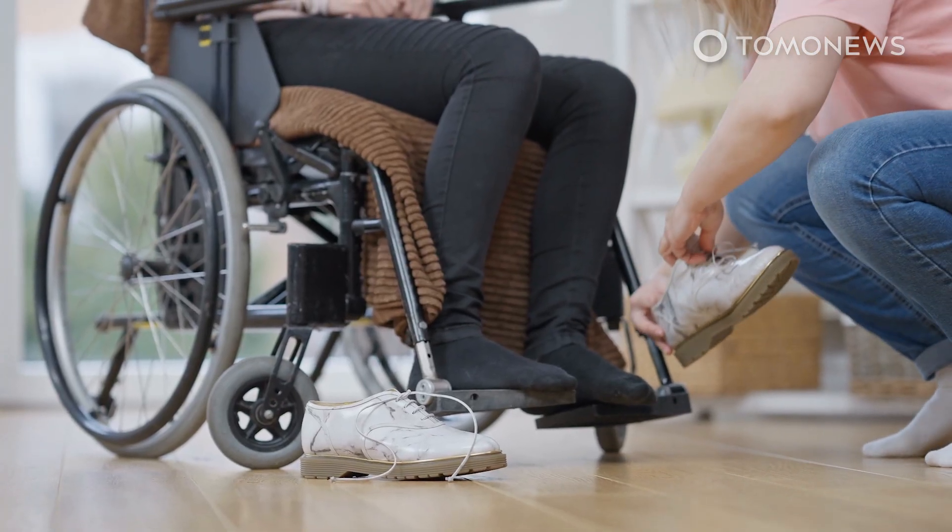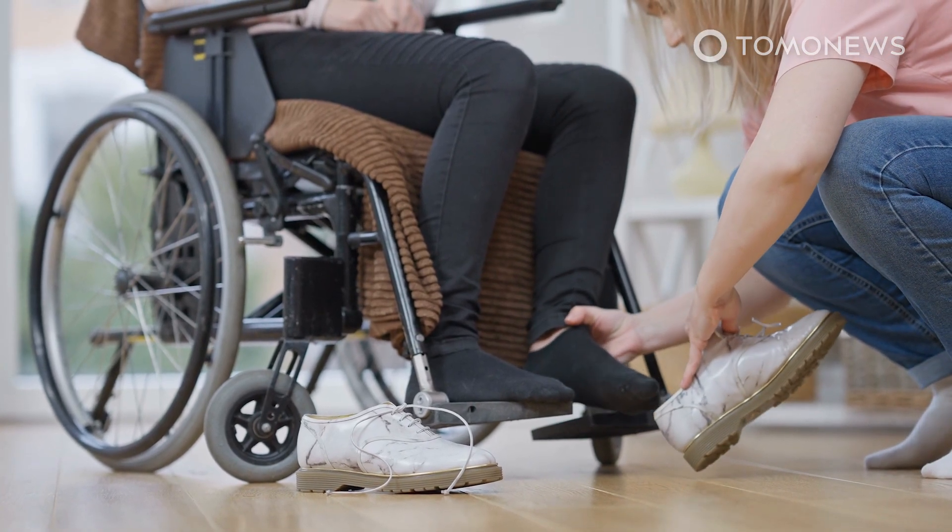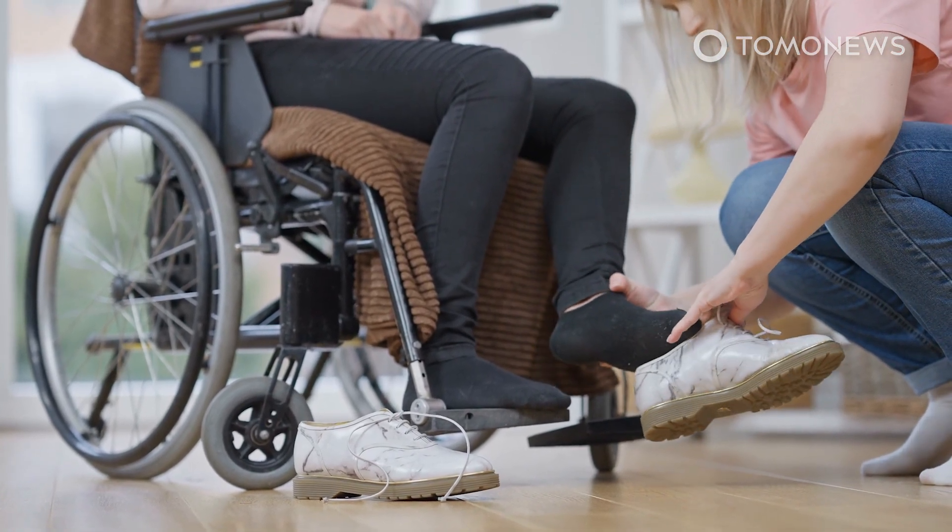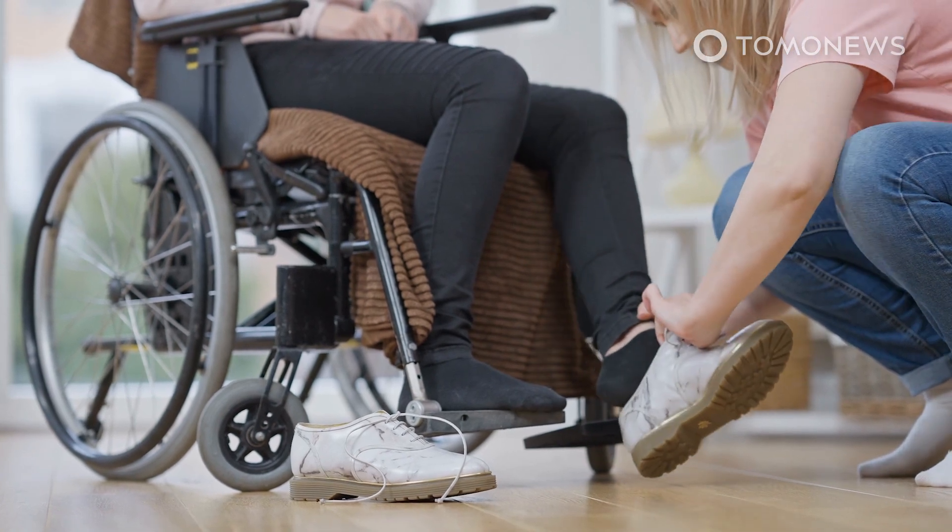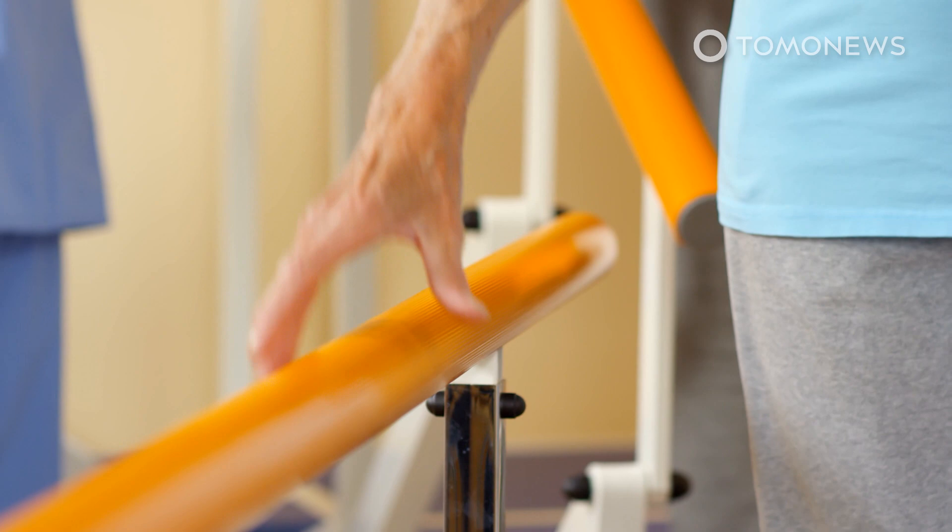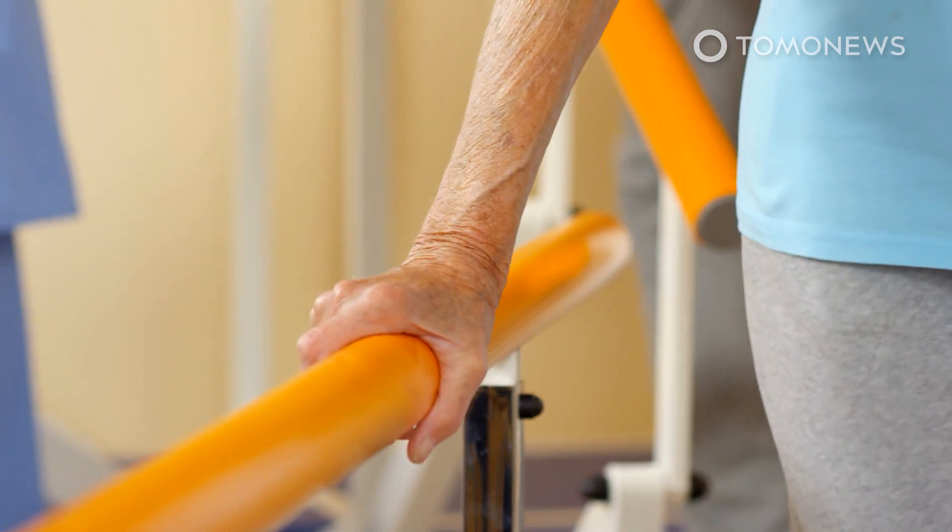None of the nine people who have received the implant use it to help them walk in their everyday lives because that is too complicated at this stage. Instead, they use it to practice walking, which exercises their muscles, improves their health, and often restores a little bit of movement.